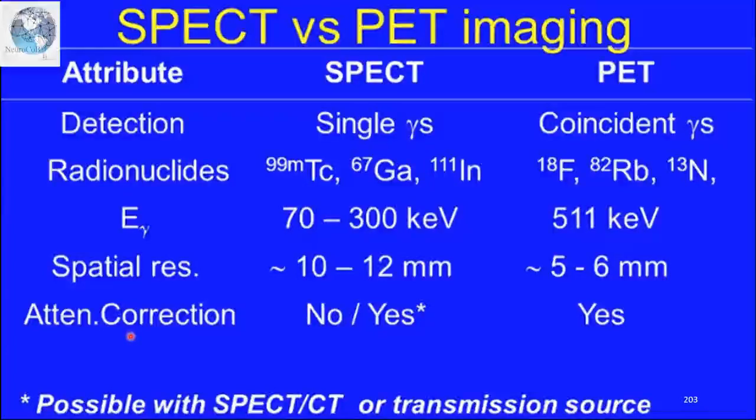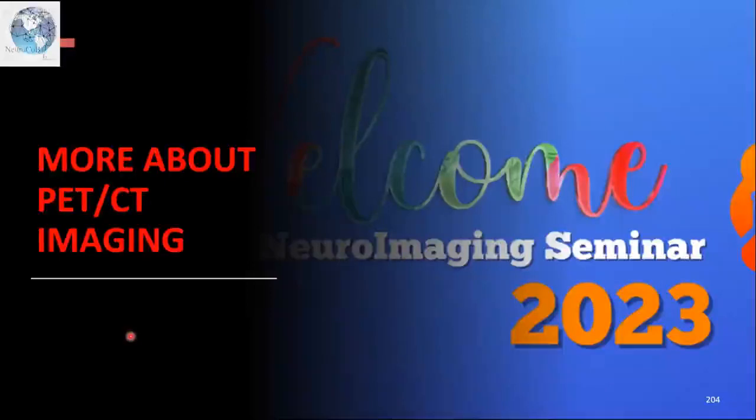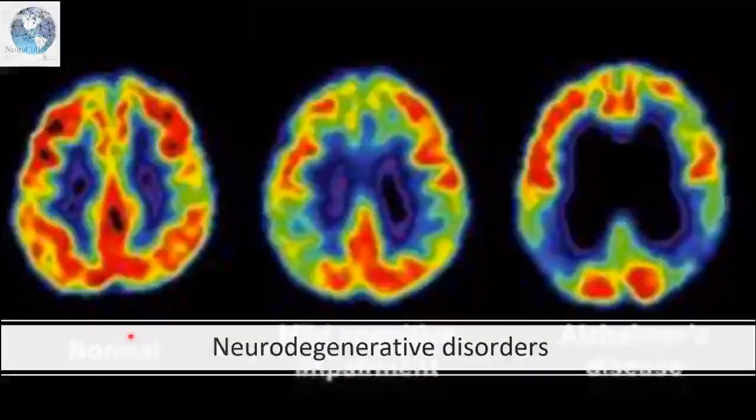Okay, so sekarang dengan teknologi hybrid yang ada dua teknologi dalam satu mesin, can have improved attenuation correction. Dulu kadang-kadang kalau kita nak image heart, bawah ada bowel dekat, so kita susah nak tahu ni dari heart ke dari bowel. Tapi dengan sistem CT yang boleh improve the attenuation correction, a lot of technical advances di mana kita lebih accurate lah dalam diagnosis. So now tadi kita dah bandingkan jenama X dengan jenama Y, kita pergi more detail on PET. Okay, we will just talk about PET now.